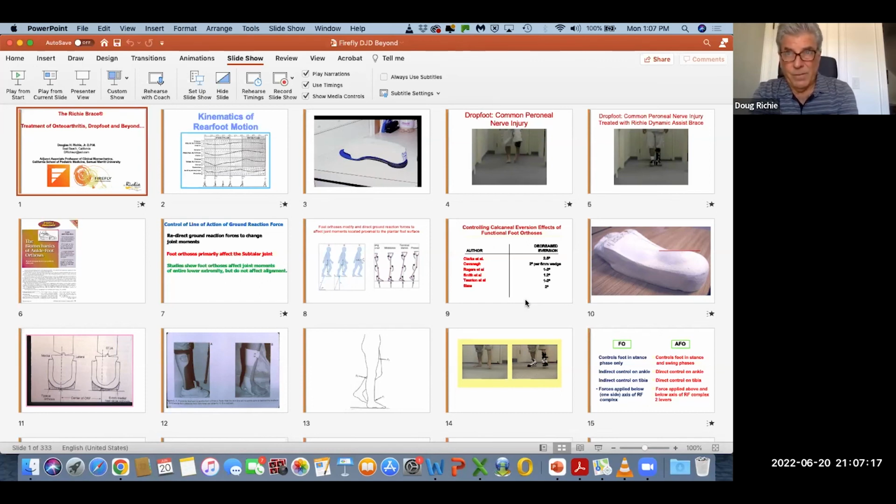And I know that there's clinicians that are just very trusting of their own ability with foot orthoses, like Rich Blake and like Kevin Kirby, where they push the envelope with foot orthoses. And in Kevin's case, he combines it with a high top hiking boot to try to get some of the effects that I showed you in my slides. So, that's his choice. I prefer not putting patients in hiking boots, but whatever it takes and what works in your hands obviously tends to direct a lot of your treatment decisions.